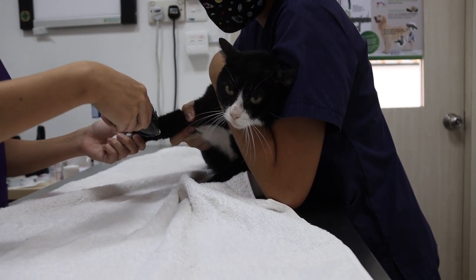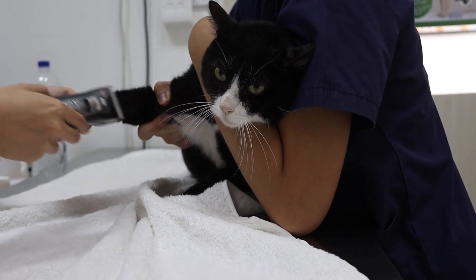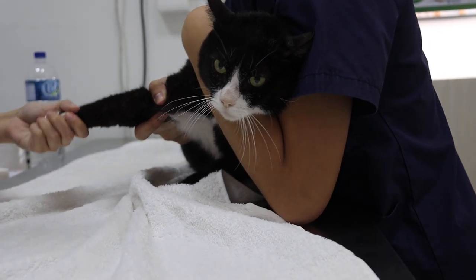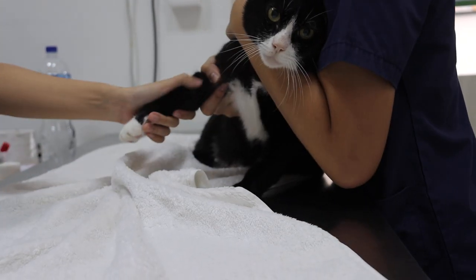We'll start to shave the area where we're going to draw blood from, so we can see the vein clearer. After that, apply disinfection.